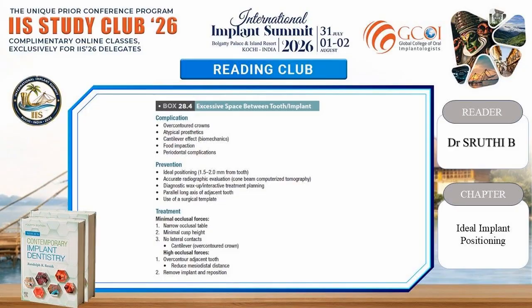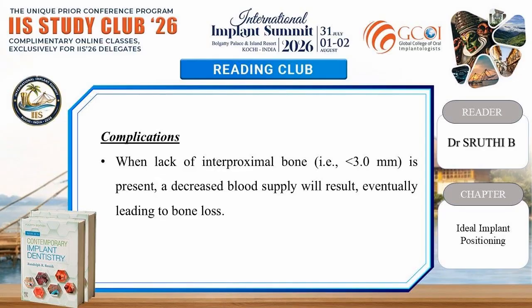Treatment: minimal occlusal forces, narrow occlusal table, minimal cusp height, no lateral contacts, that is cantilever, over-contoured crown. High occlusal forces, over-contour adjacent tooth, reduce mesiodistal distance, remove implant and reposition.